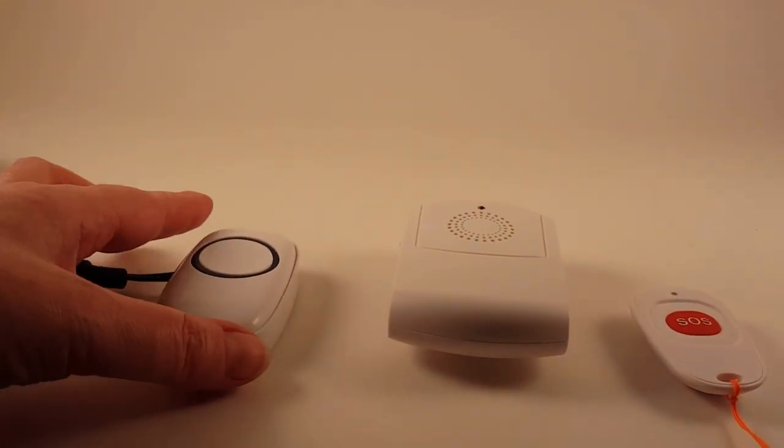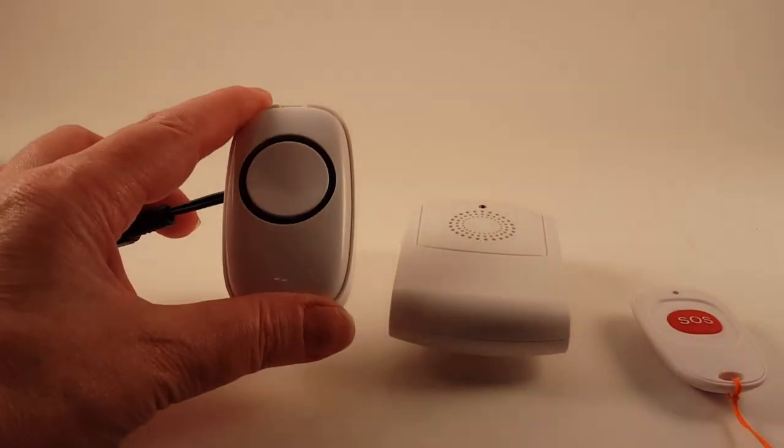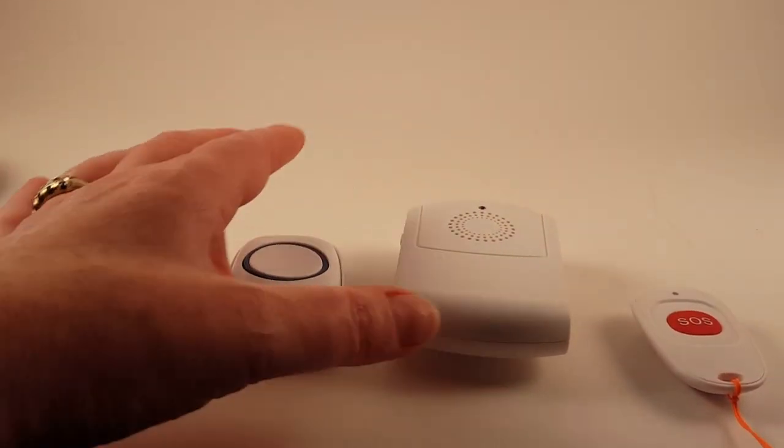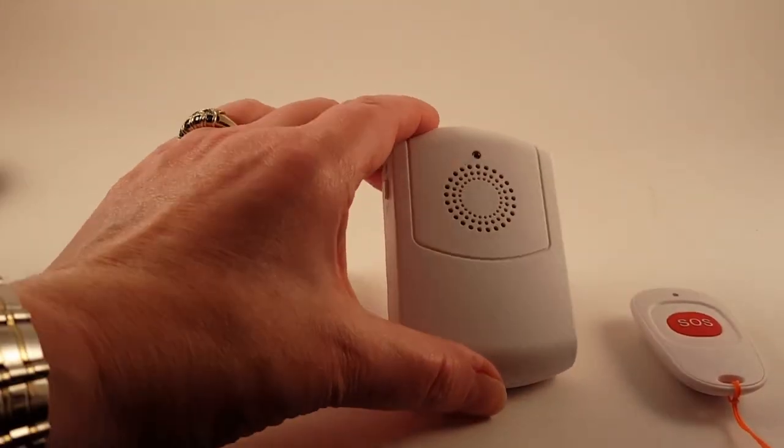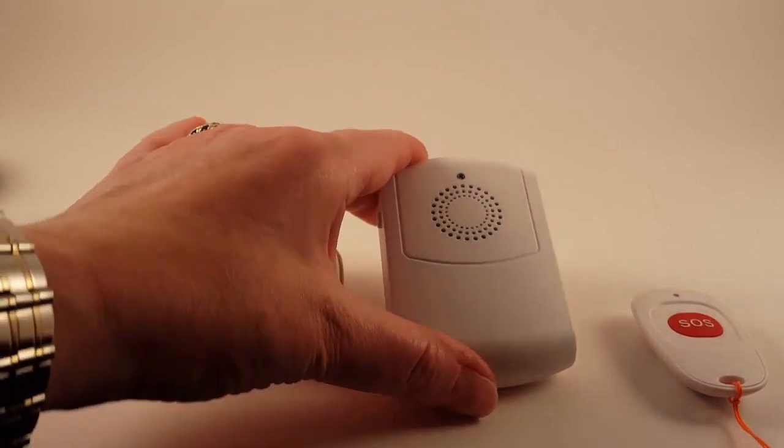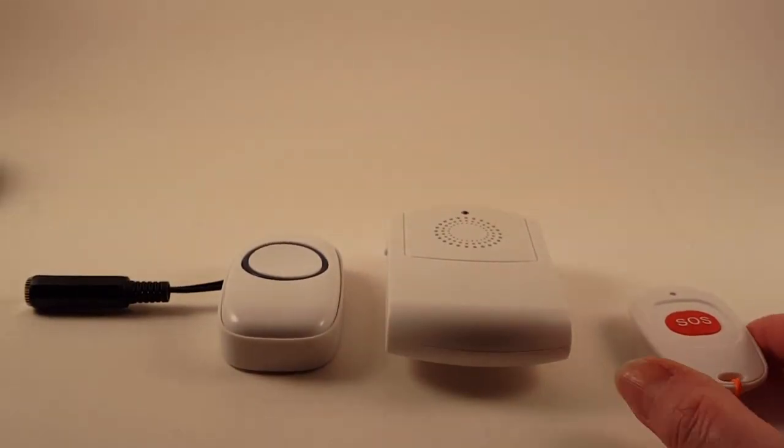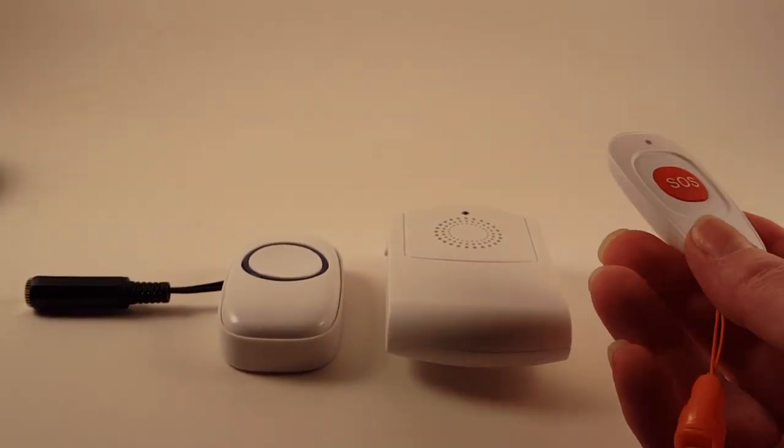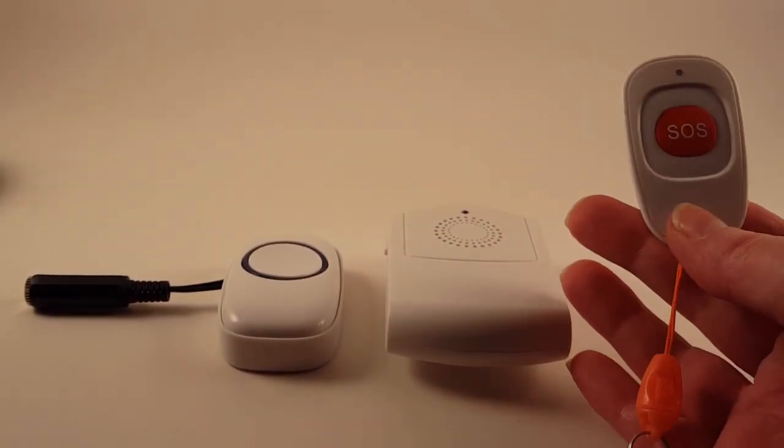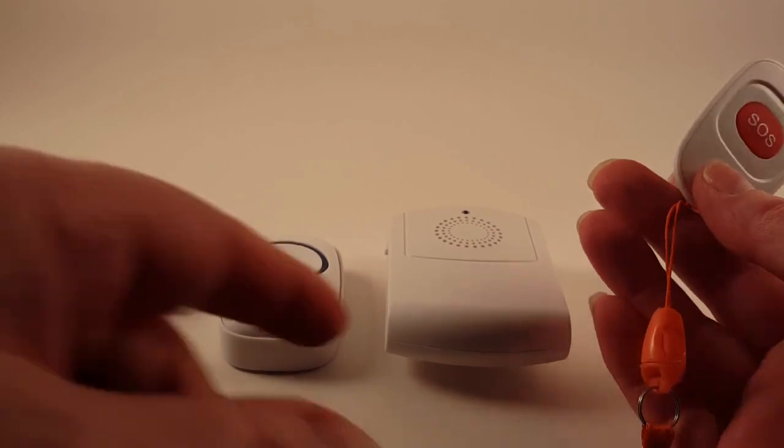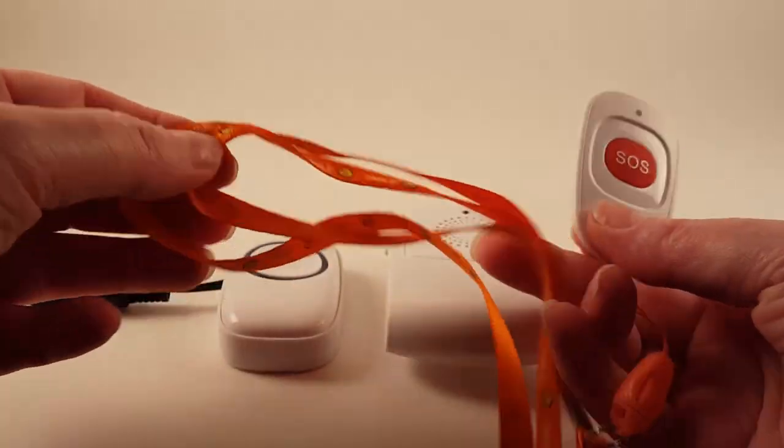This is our wireless caregiver alert. It has a transmitter, a receiver which is a chime, and then it also has an optional transmitter that has a neck loop on it.